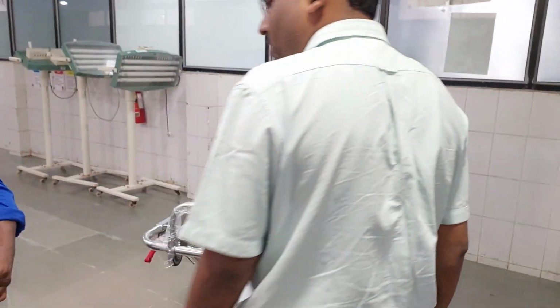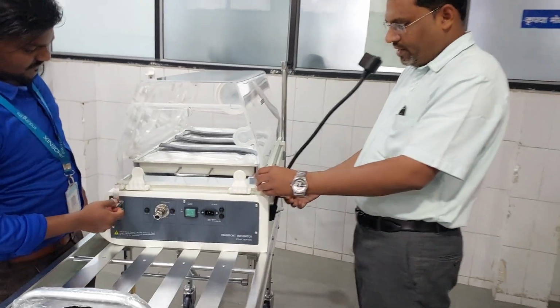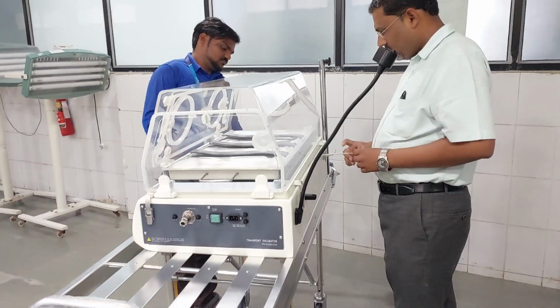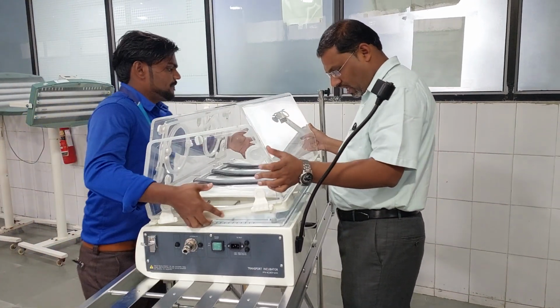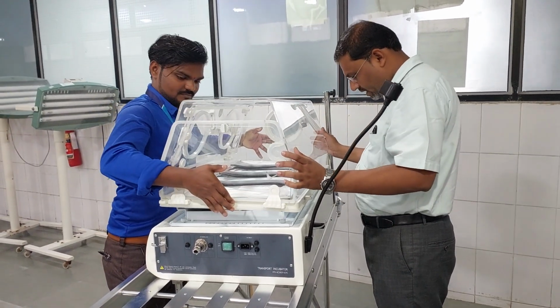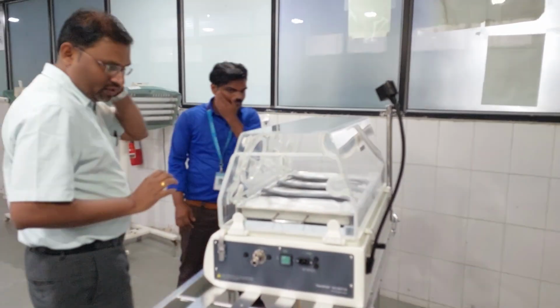After that, this is the upper cover of this incubator. You have to keep it like this, properly. They have provided this locking. One minute, I will tell you this. Don't make this mistake. It is always from the inside, otherwise it will get cut. It will be from the inside, and then you just keep it, and after that, just lock it. Okay, now it is locked.